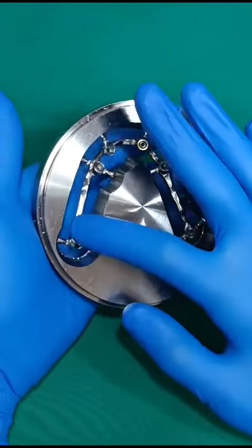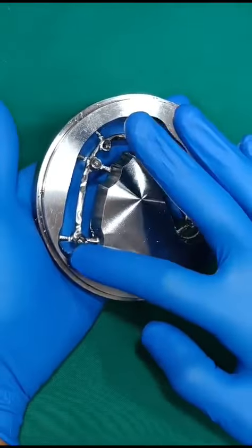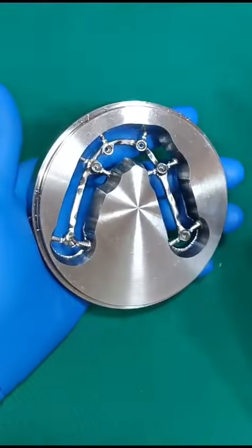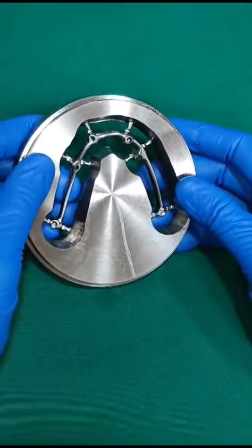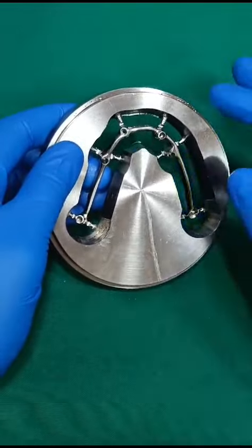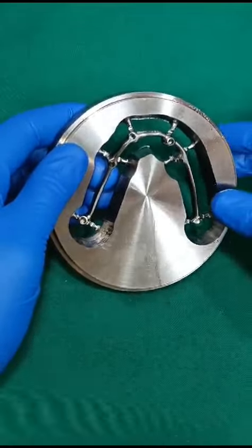The titanium bar behaves exactly similar to bone. It transfers occlusal forces very effectively, so the implants integrate very well without any disturbance. This is how we avoid zygomatic implants — even when a zygoma is indicated, we can avoid it successfully and predictably.